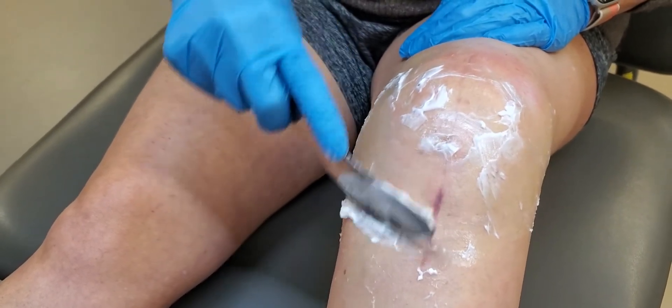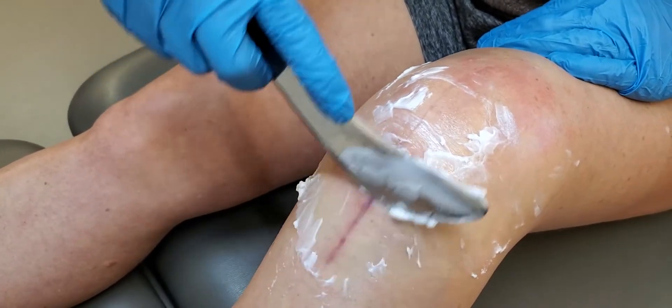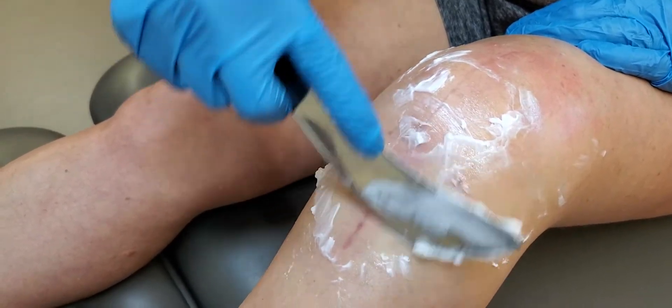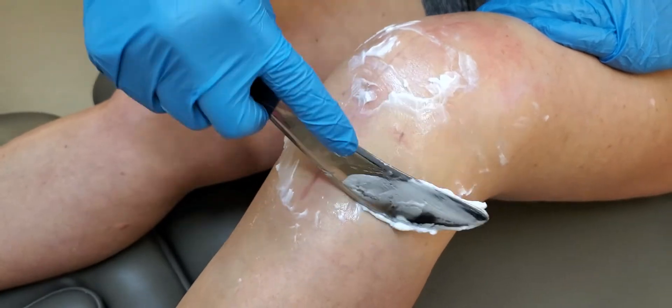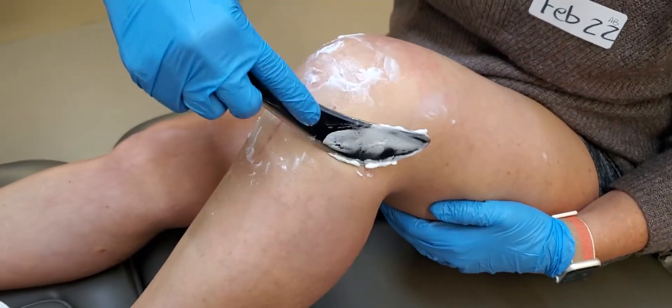Thus, this would be the tissue that we would want to potentially spend a little bit more time on. It's going to be sensitive right over the incision. Doing this at different degrees of knee flexion will also bias and implicate different tissue.